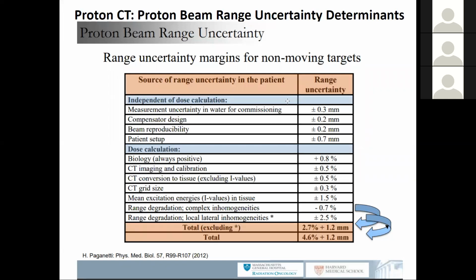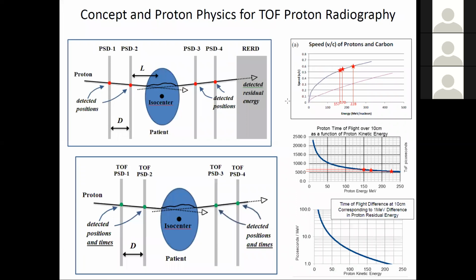And this is radiation oncology, so you're doing your damnedest to reduce your margins and know exactly where everything's going on. So you'd like to have feedback as to where the protons are going. This was some work we did a couple of years ago, and it's still ongoing, but I'm waiting for the detectors to get a little bit better and get back in the beam.